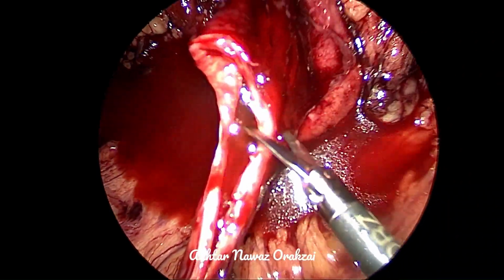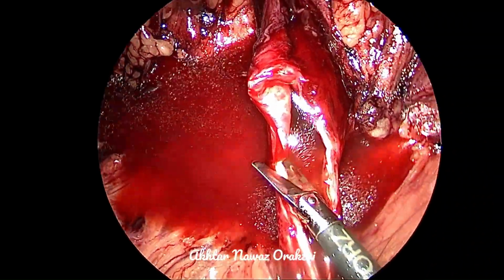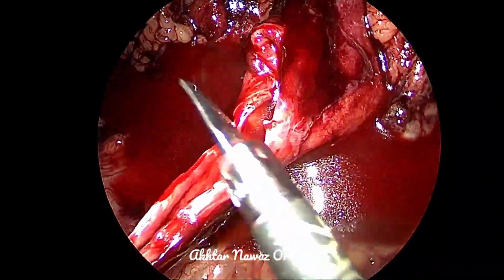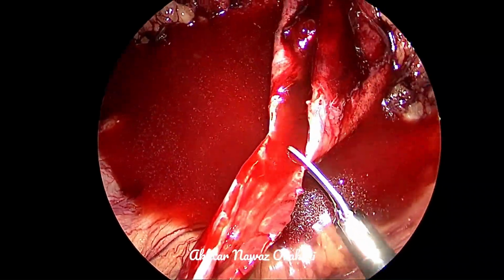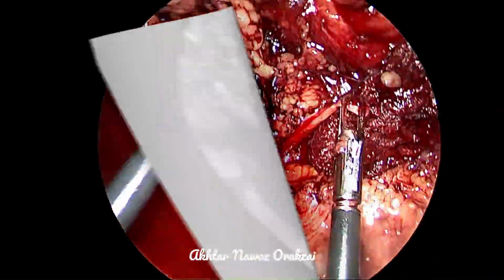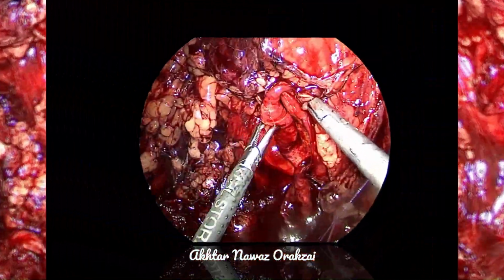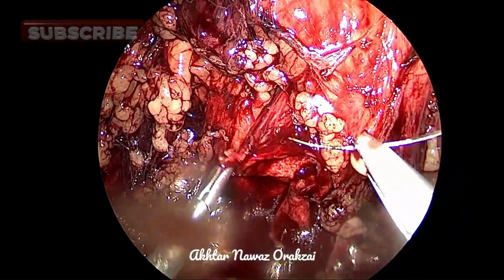Care must be taken not to over-resect, because there is no need to resect the pelvis too much in this case, because the pelvis size is quite reasonable. Both the edges should be cut in the same manner, and after that we will see whether the corner is coming. Yes, so they can be approximated very easily without any tension.